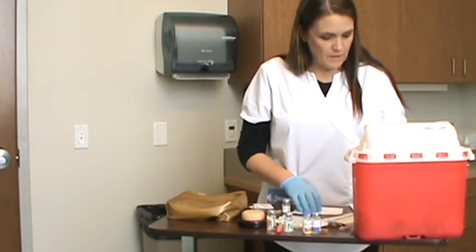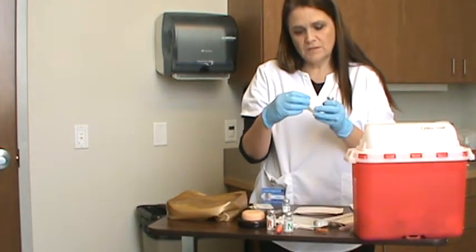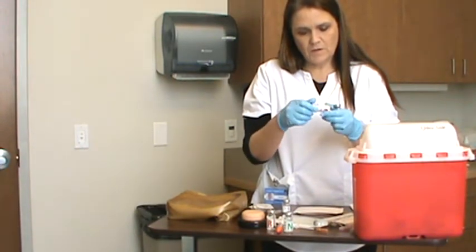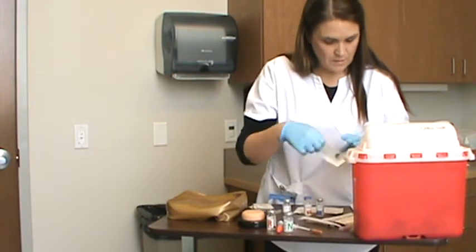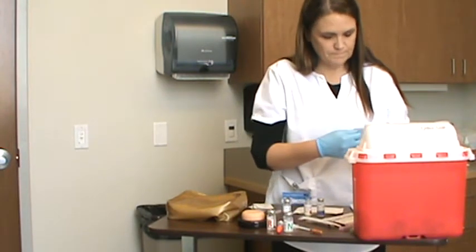And so on the Ampicillin, you have to reconstitute. This is the Ampicillin, 400 milligrams, 7.5 is what I need for the sterile water, expires 2020, the sterile water 2024. So I would draw up the sterile water, so it's 7.5.